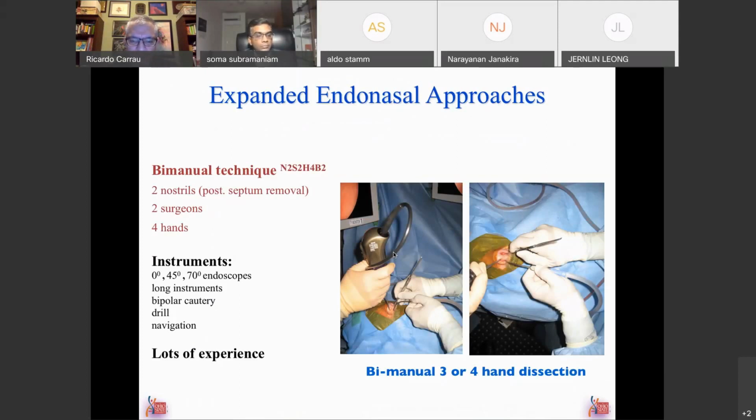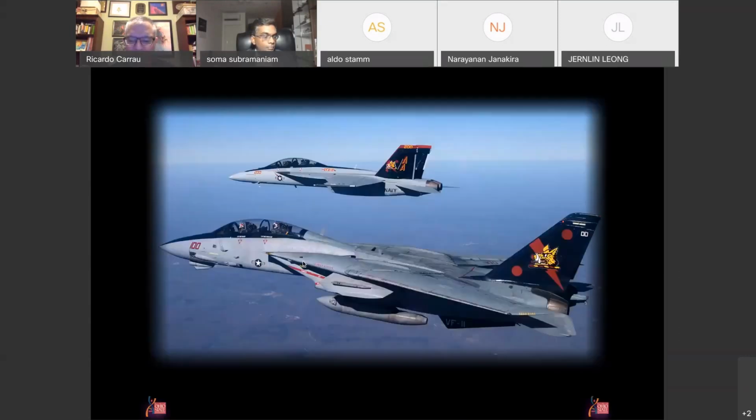By this time, you all know that we use 2 surgeons and a bimanual technique. Again, this is the critical concept. How you use the 2 surgeons and how you visualize, you have to adapt to your own circumstances, and whether you are right-handed, left-handed, etc. We try to have the surgical field or the nostril completely free, so all the cables are going away. My preference is to put them to the head of the patient, but if you prefer to do it to the side, one side or the other, that's okay, as long as this area over here is unencumbered by cables or other instruments.